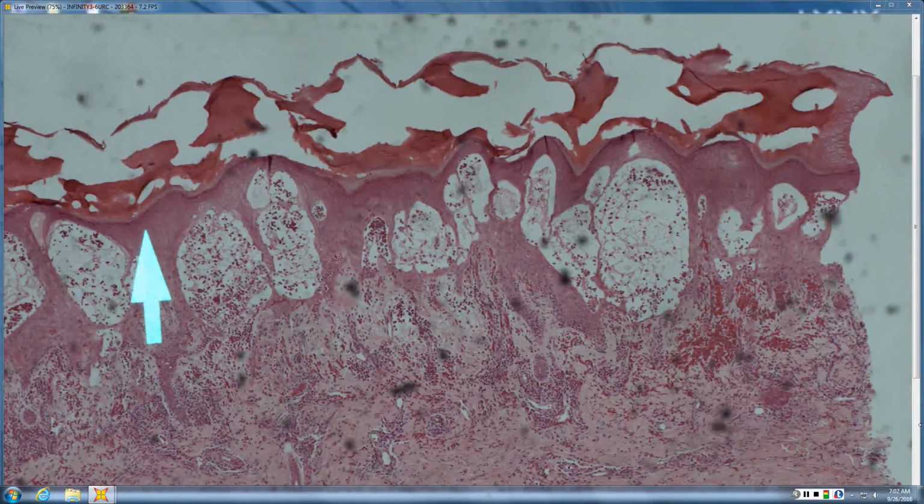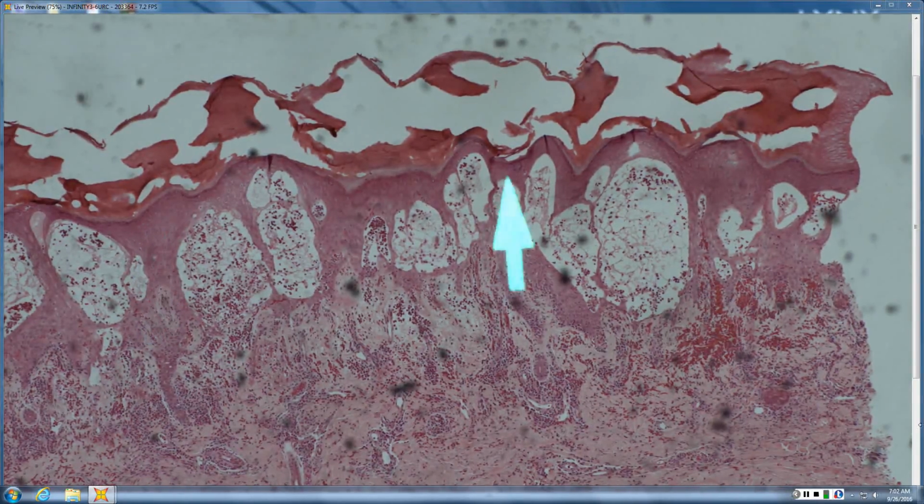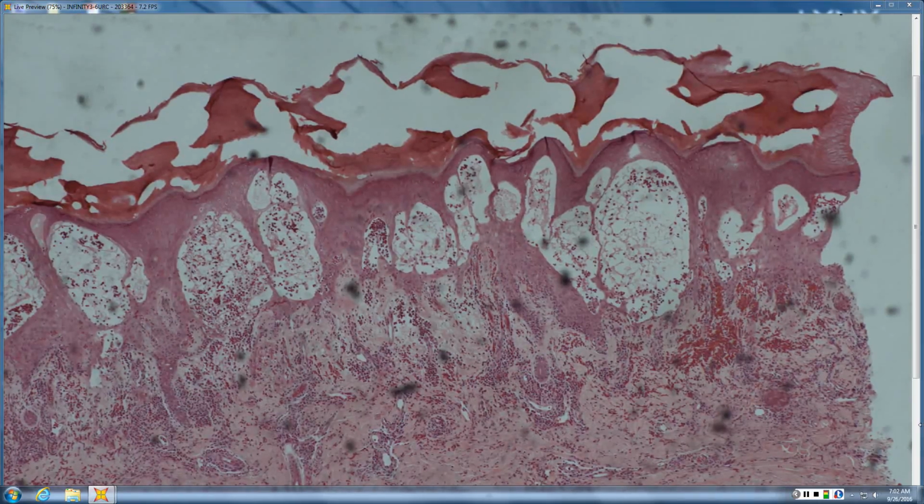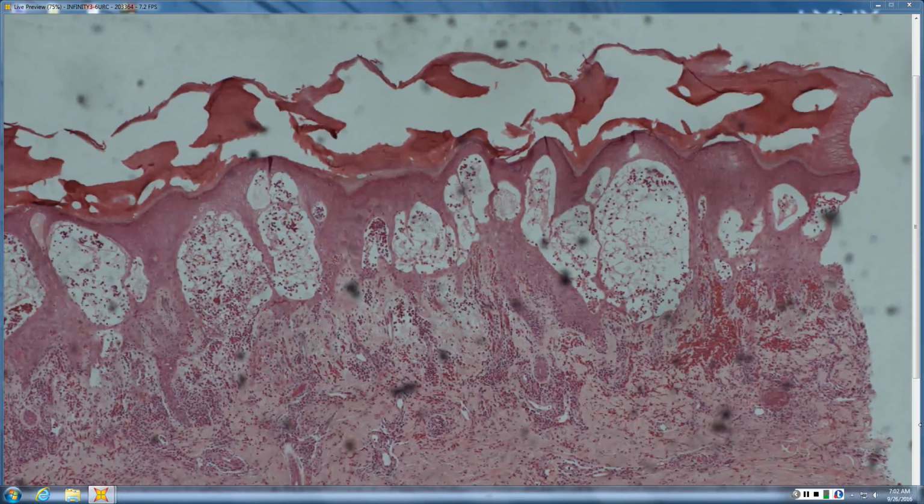So allergic contact derm is going to be the more common one. Atopic dermatitis, tinea, and then scabies, which is basically arthropod. So that's really all you can say from this. You can't say anything else unless you see an obvious scabies up here or something. This is just an eosinophilic spongiotic process, and it brings up a differential. But that is really good for acute. You can see how this is very different from something that's more chronic. These are acute vesicles that have formed.